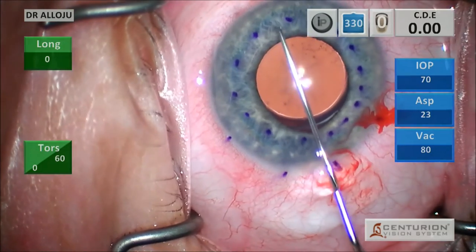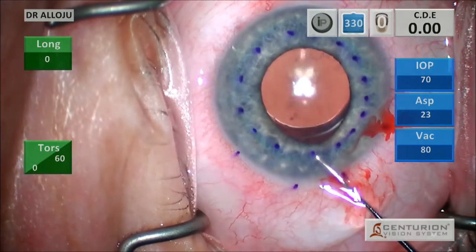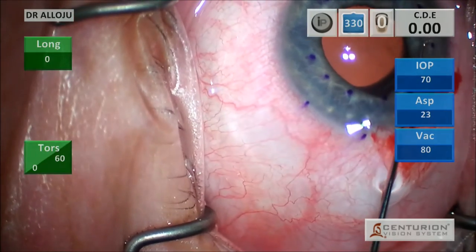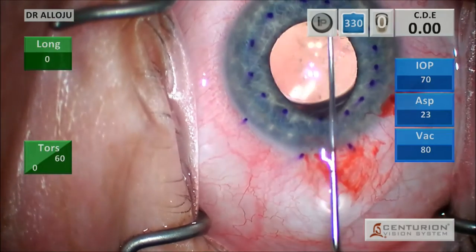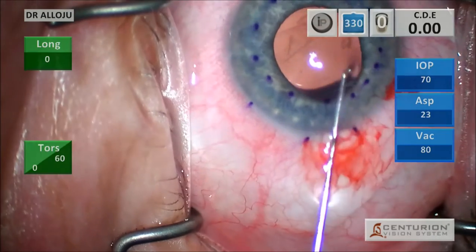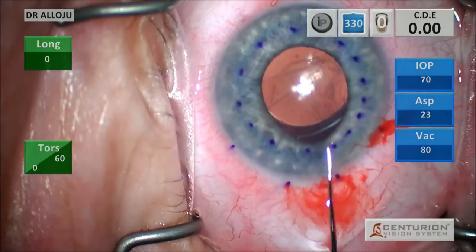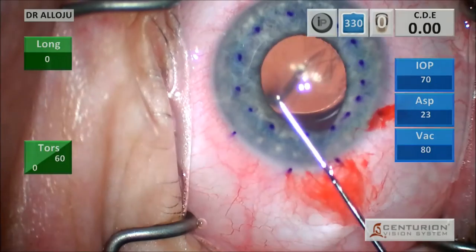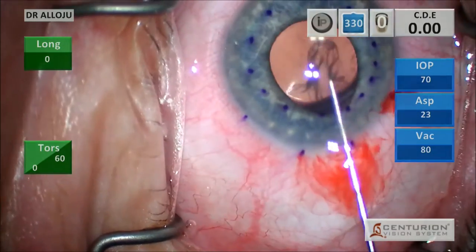So here I'm using a reverse Sinskey hook, and I'm just going to score the Descemet's membrane endothelium. And then you can essentially grab one of the edges, and it should peel. If this is a typical Fuchs patient, Descemet's membrane endothelium will peel off in a nice sheet. Now it's important not to leave any tags, because these tags can actually promote detachment of the graft.